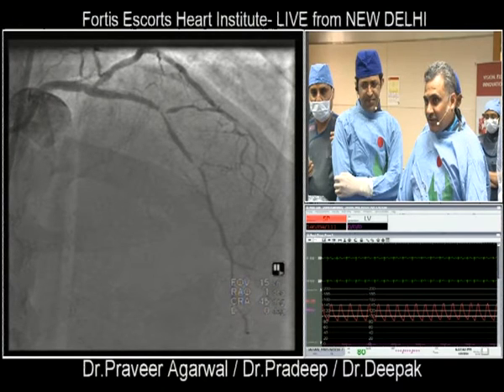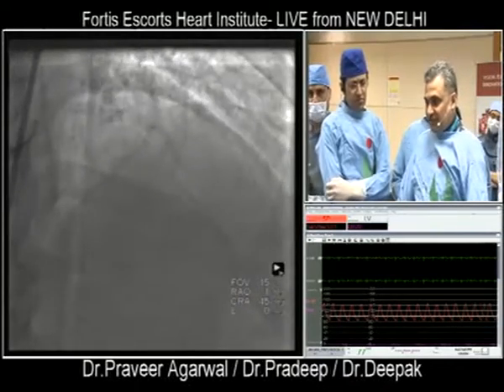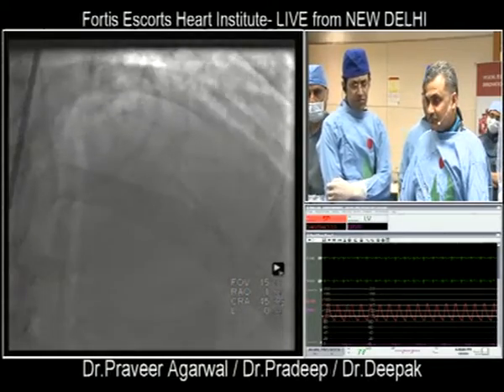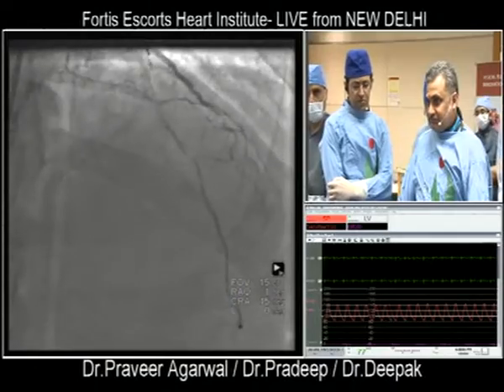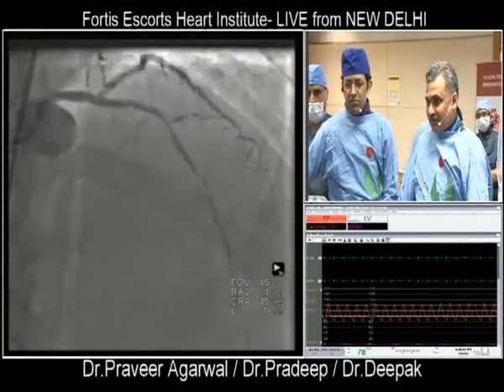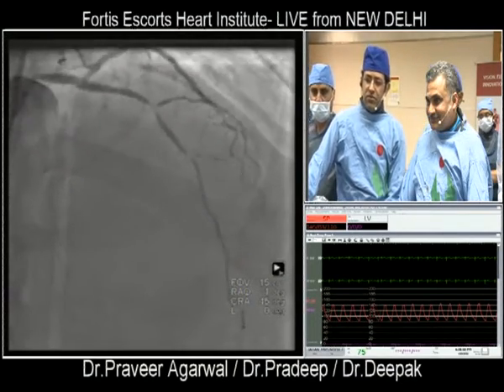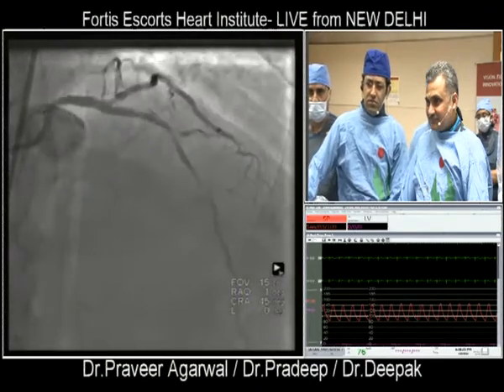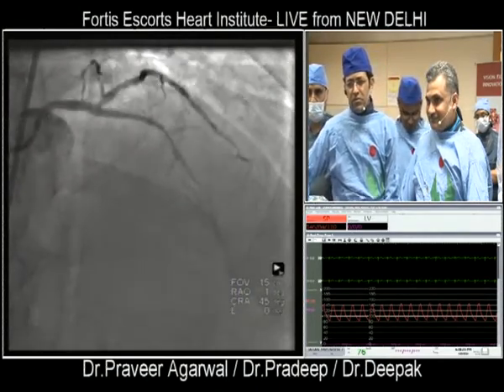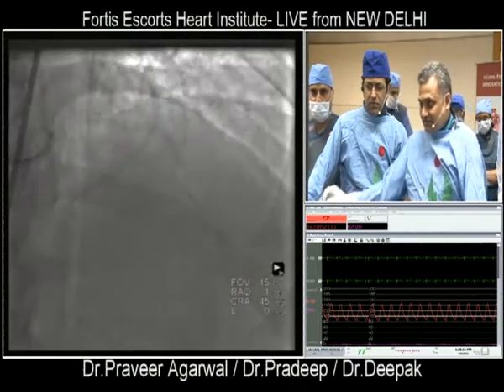With two stents or with one long stent, what is your strategy for this? Just to make room there and see how we take this small vessel with a drug balloon, and maybe do a focal stenting if the need arises. What do you say? Or would you go straight away for stenting? I think the risk of dissection with balloon only is much higher because it is a very severely diseased and small lesion. In my opinion, I would prefer to stent the whole mid LAD. I totally agree with you.